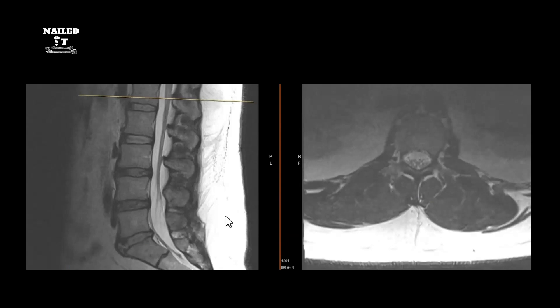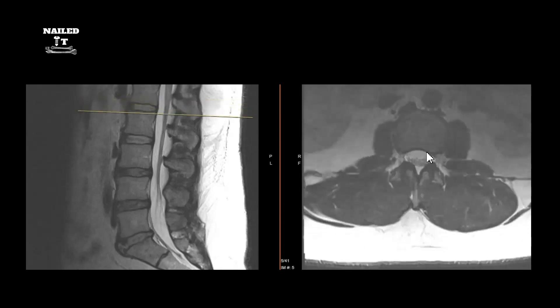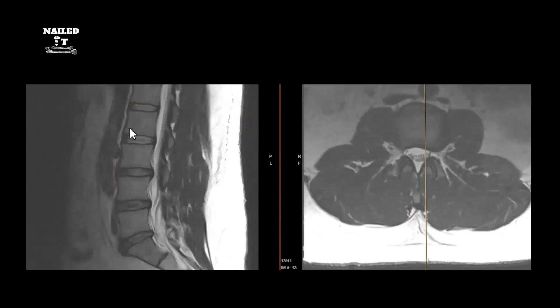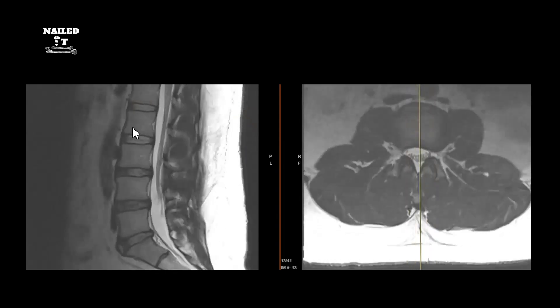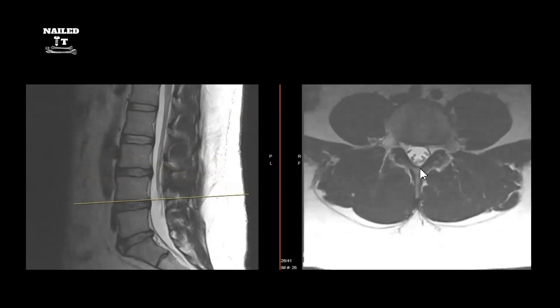The two types of images we look at on MRI are sagittal and axial. The sagittal view on the left is like looking at the spine from the side — you cut slices and view it from the side. The axial view is like looking at the spine from the top down, like cutting a loaf of bread and looking at each slice.